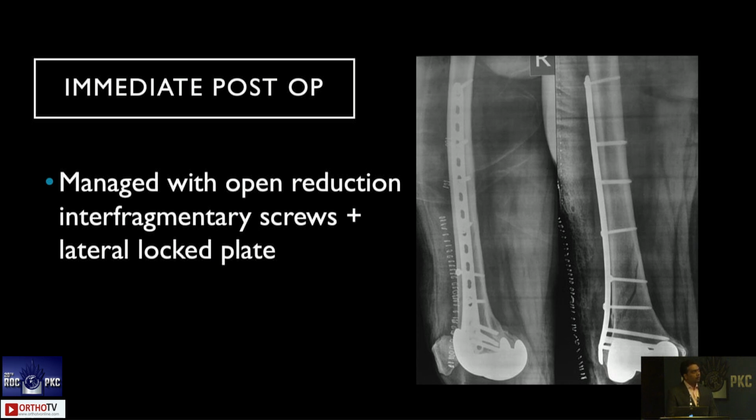Usually, when we have these fractures with osteoporosis, the bone stock is not that good. Therefore, even if we feel we are putting lag screws, they are not an actual lag screw, they just remain as position screws and do not provide that stability. In that case, if you feel such, we need to add a separate plate or put an intramedullary nail in addition to this lateral plate.